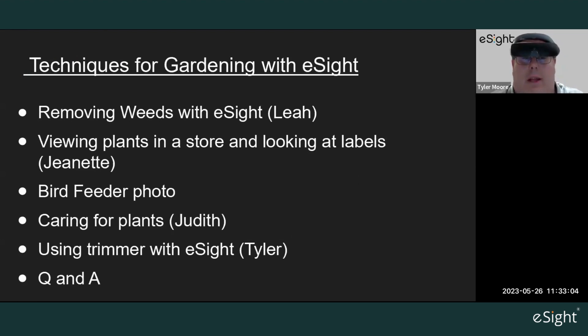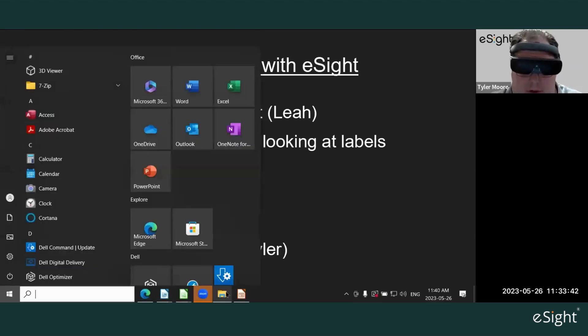For today's techniques for gardening with eSight, we're going to look at a number of things: removing weeds with Leah, viewing plants in the store and looking at labels with Jeanette, a bird feeder photo from Jeanette, a plant wall video with Judith, and I'm going to show myself using a string trimmer to remove some weeds in my front yard. Let me open the first video of Leah removing weeds.